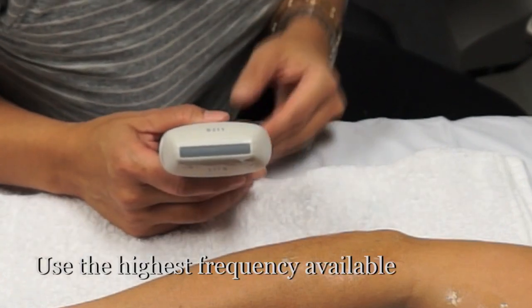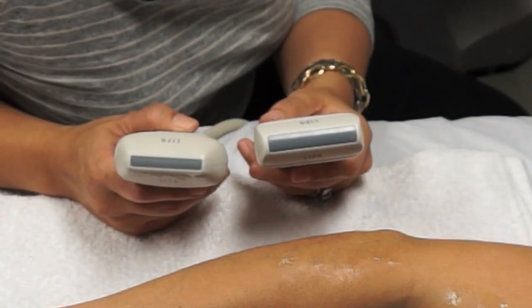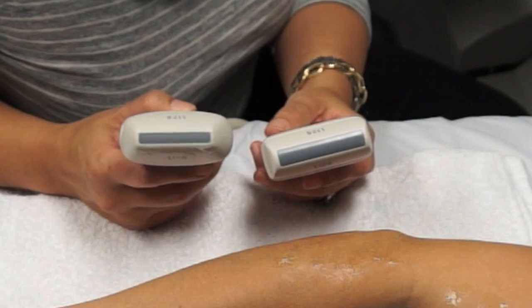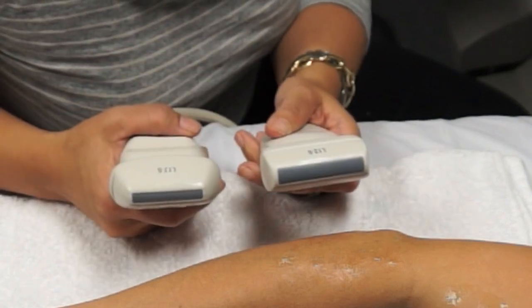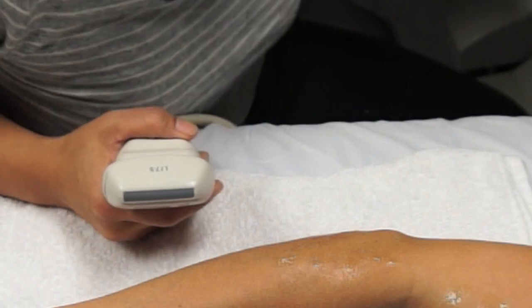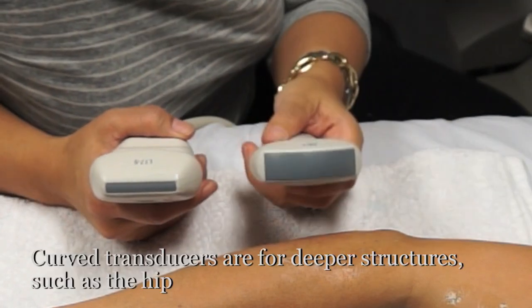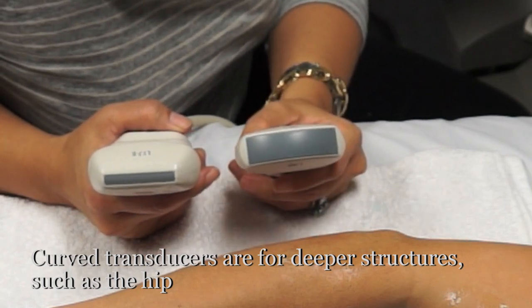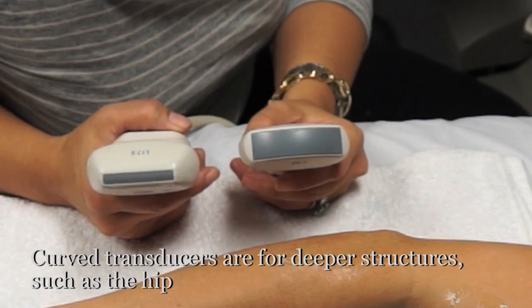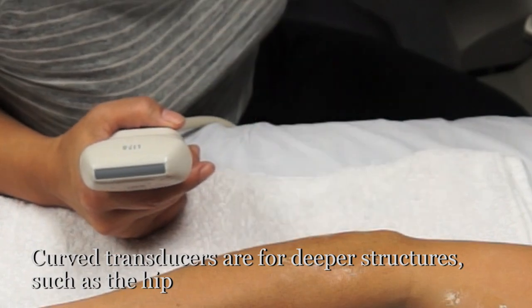Depending on the system, you may have other types of linear transducers. This is a 12 megahertz linear transducer, and you can see that this has a larger footprint. So depending on what you're imaging, you may want to use something like this. What you want to avoid is using a curved transducer such as this 5 megahertz curved transducer, and this is generally used for the abdomen or for deeper structures, so you may need to use it for something deeper such as in the hip.